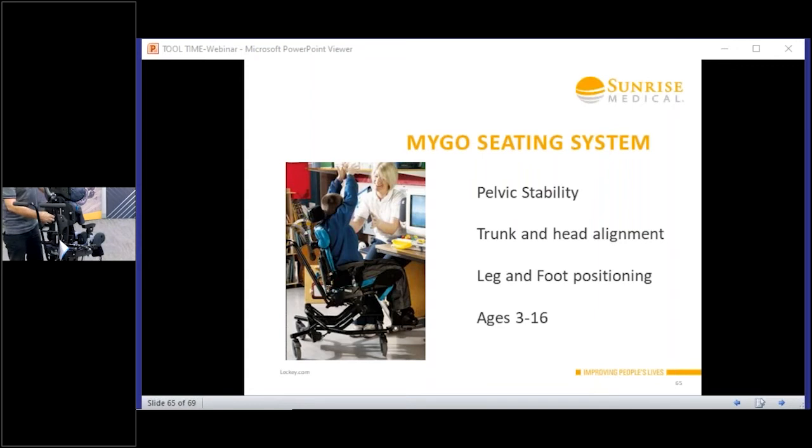With more growth, you get more inquisitive parents as well. And so we use more Allen key tools and everything rather than hand wheels. Rob's changing the height, so I'm going to reduce the height down on the backrest just by those 2 adjustments. This has got the size 2, so it's got the shoulder protractors on. It's just going to give you that extra height before you even start. So you can use it with or without that option. It's just bolt on and bolt off if needed. And then you've got the additional height that you gain from there. So really you're getting an extra 6 inches of height and growth out of this chair.